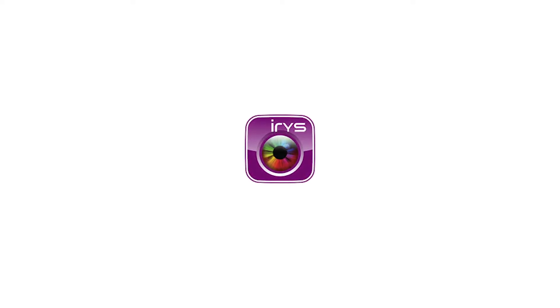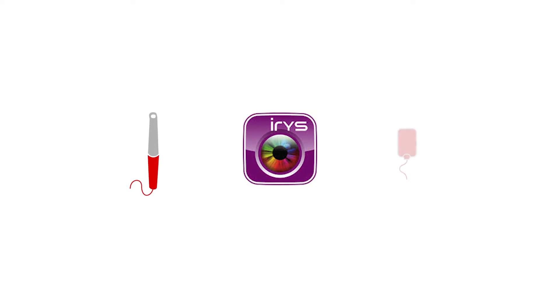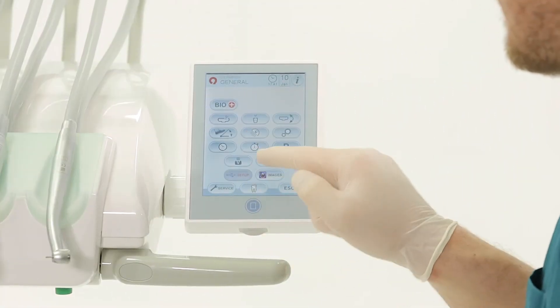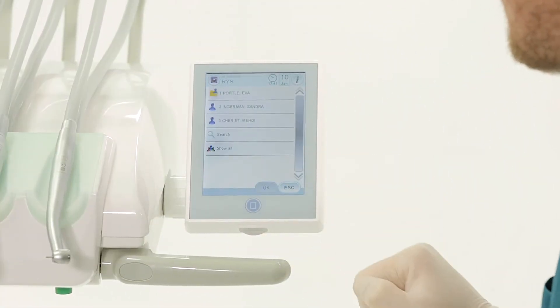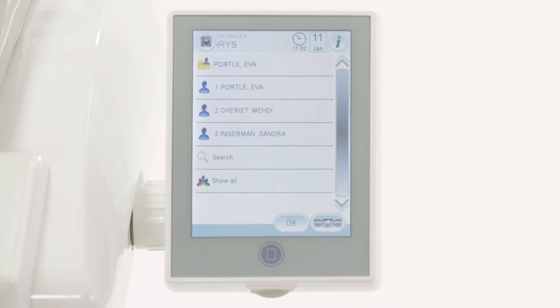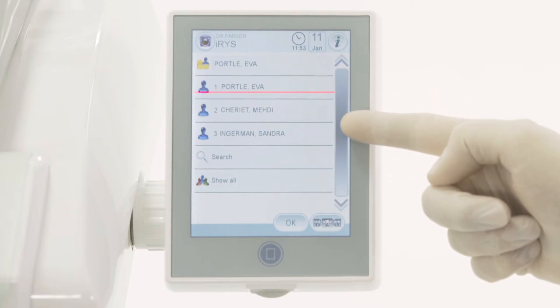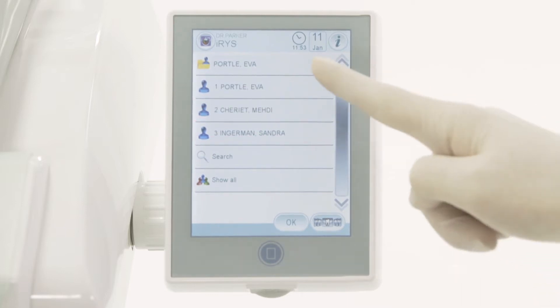Direct access to the patient database can be obtained via the iris software supplied with a camera and x-ray sensor. At the top of the list is the name of the last patient whose clinical record has been consulted. The most recent patient file history is shown below.